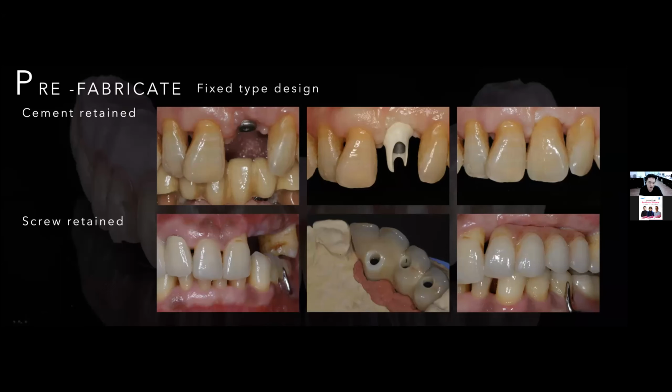So when we get the model, we can check every point, every area, and every angle, and maybe we can help dentists to make a more right choice. Maybe we can help the dentist to adjust the treatment plan later. But if possible, no problem, we just follow the dentist's order.